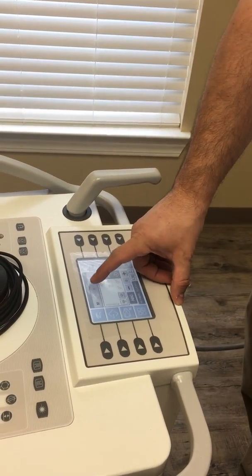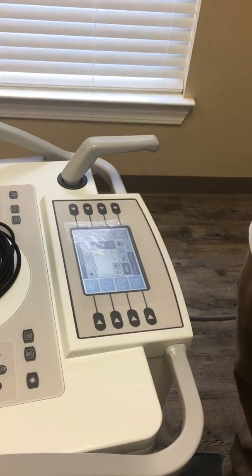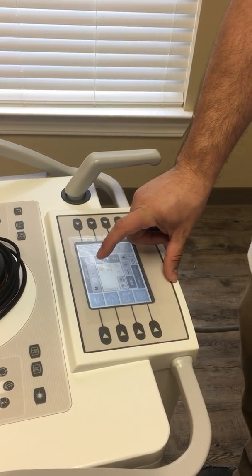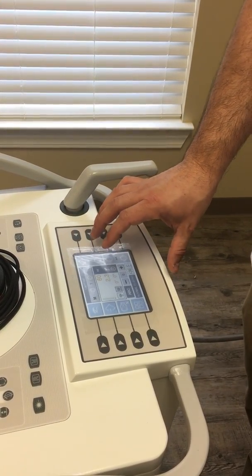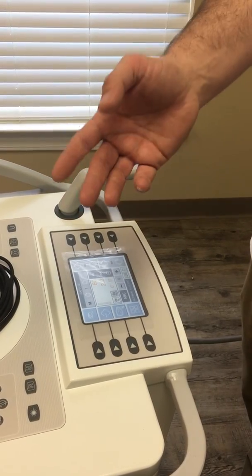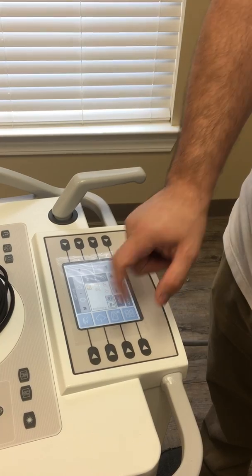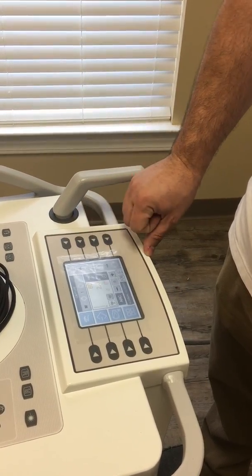And these arrows here, this will make more sense as I flesh out the software, but once we have a study up and you have images that you've acquired, you can actually cycle through the images on the right-hand monitor. From here, you can pick which one is being viewed. So in case the doctor needs to do a comparison, you can cycle through the previously acquired images. And when we're in manual mode, so that's auto, manual, there's our KV, MA adjustments.